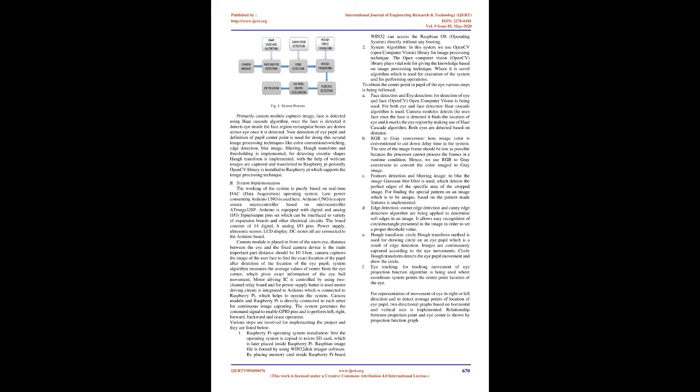9. In this paper, an EPW, electrical powered wheelchair, controlled by an eye-tracker system based on a fuzzy logic controller is presented to improve the level of perfection in intelligent or electric powered wheelchairs. By using the Viola and Jones technique, the region of each eye is extracted and treated as an individual image. The captured images are converted from grayscale to binary images using a constant threshold, which is not appropriate for each and every luminance condition.